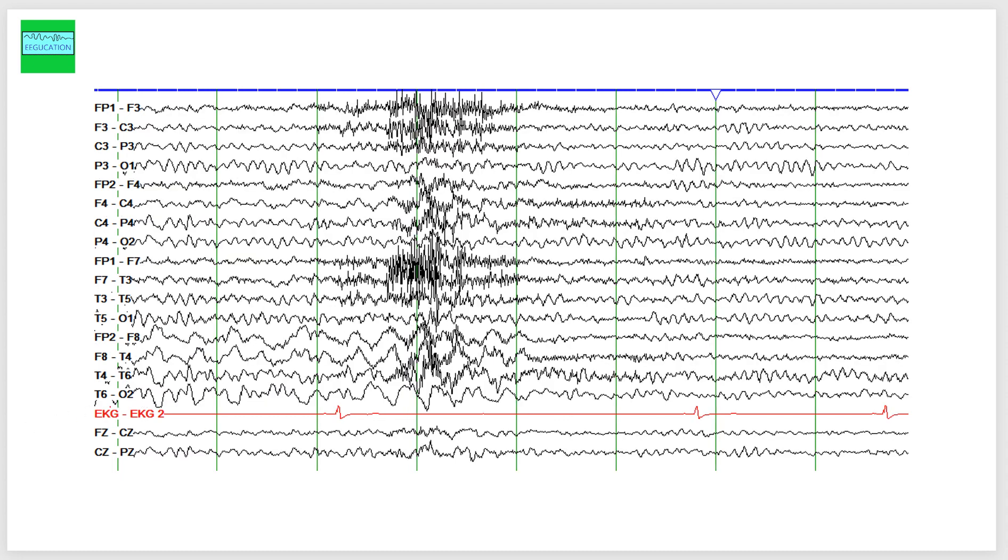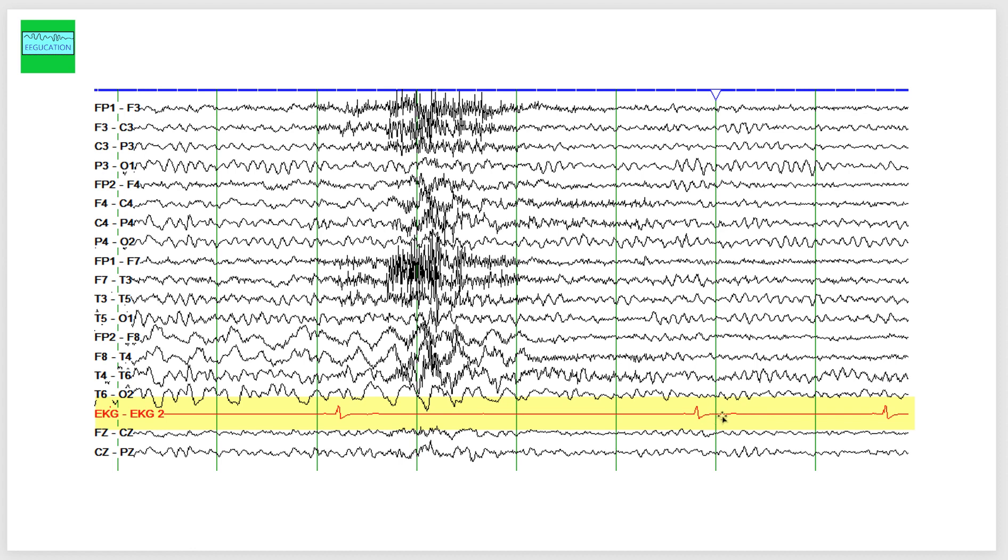Looking at the next page, you see the end of the seizure. Right here, the rhythmic slowing or polymorphic slowing in the right temporal head region has ended here. The last three to four seconds of the ECG appear more or less normal. But if you look at the ECG, there is a very significant drop in the heart rate, almost four seconds of a pause. And this patient later had a Holter recording, so continuous recording of the heart, which showed pauses that lasted as long as seven seconds.